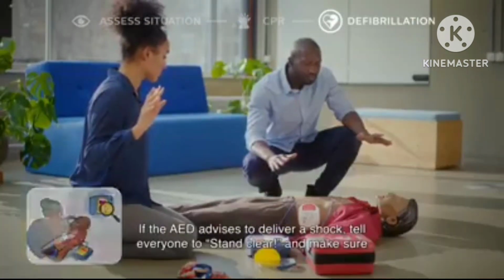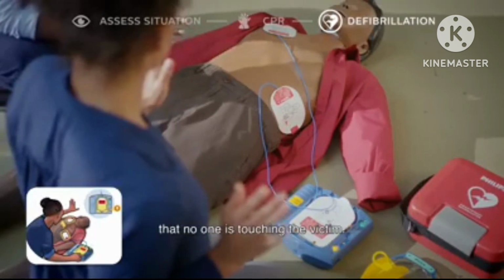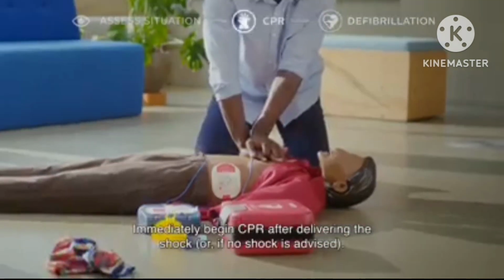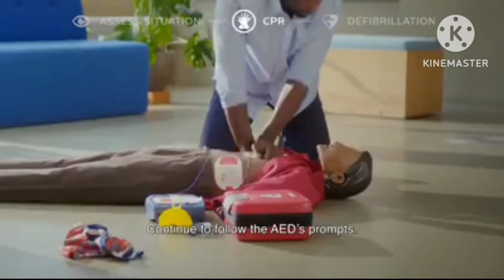If the AED advises to deliver a shock, tell everyone to stand clear and make sure that no one is touching the victim. Once clear, press the shock button if necessary. Immediately begin CPR after delivering the shock or if no shock is advised. Continue to follow the AED's prompts.